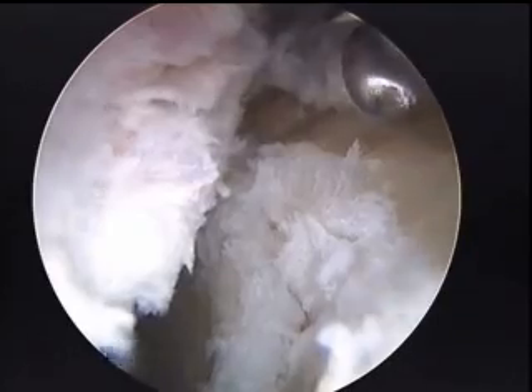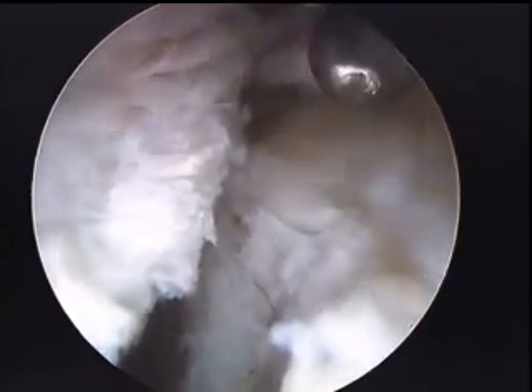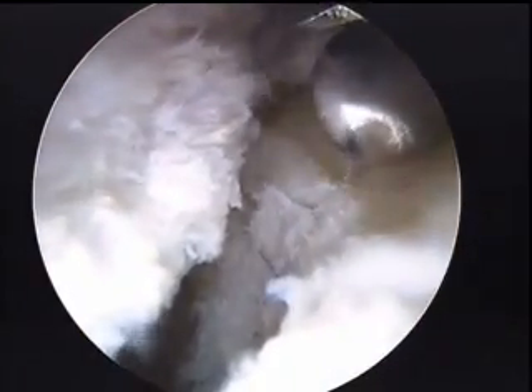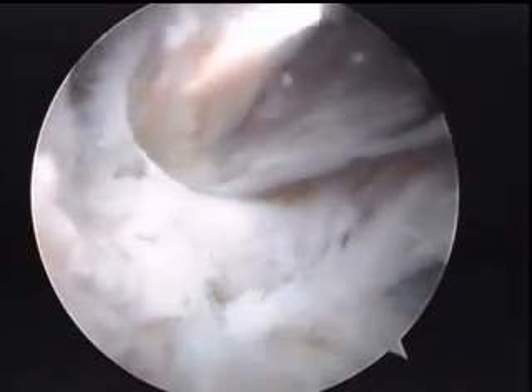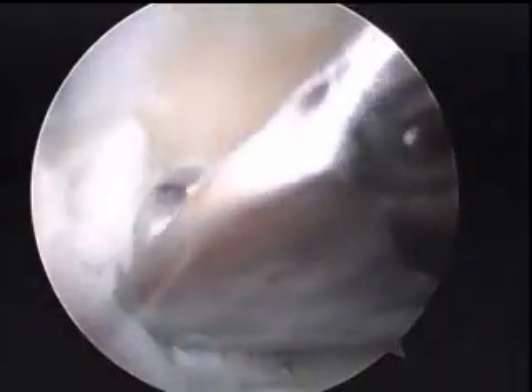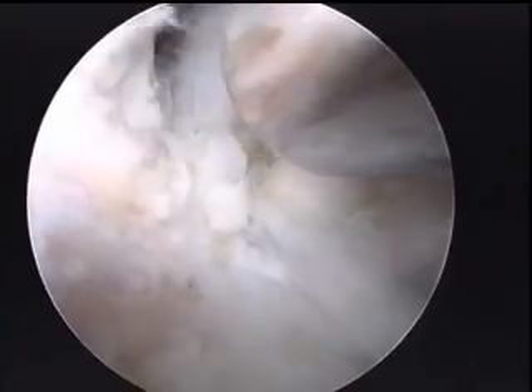This is the area where we can't bring the rim all the way down — this is the area of the delamination. If we brought it all the way down here, we would start destabilizing his hip from taking too much bone of the acetabulum. We know from our preoperative x-rays that we can take four millimeters easily and not destabilize his hip. With the rest of the bone that we're not able to resect here, we'll use a microfracture to try and stimulate some fibrocartilage.